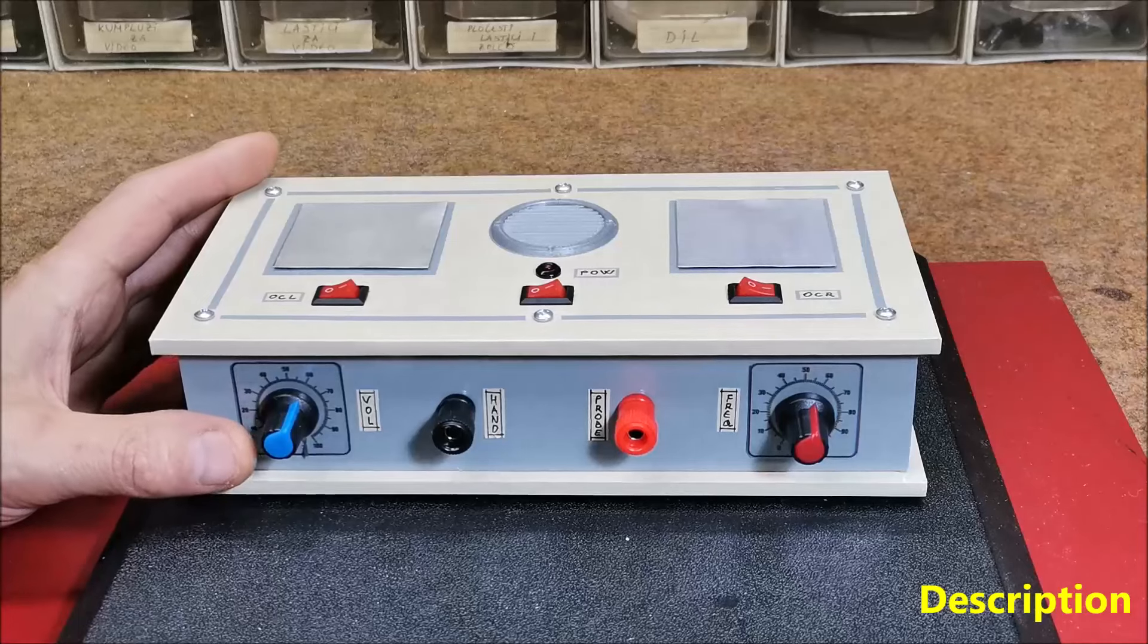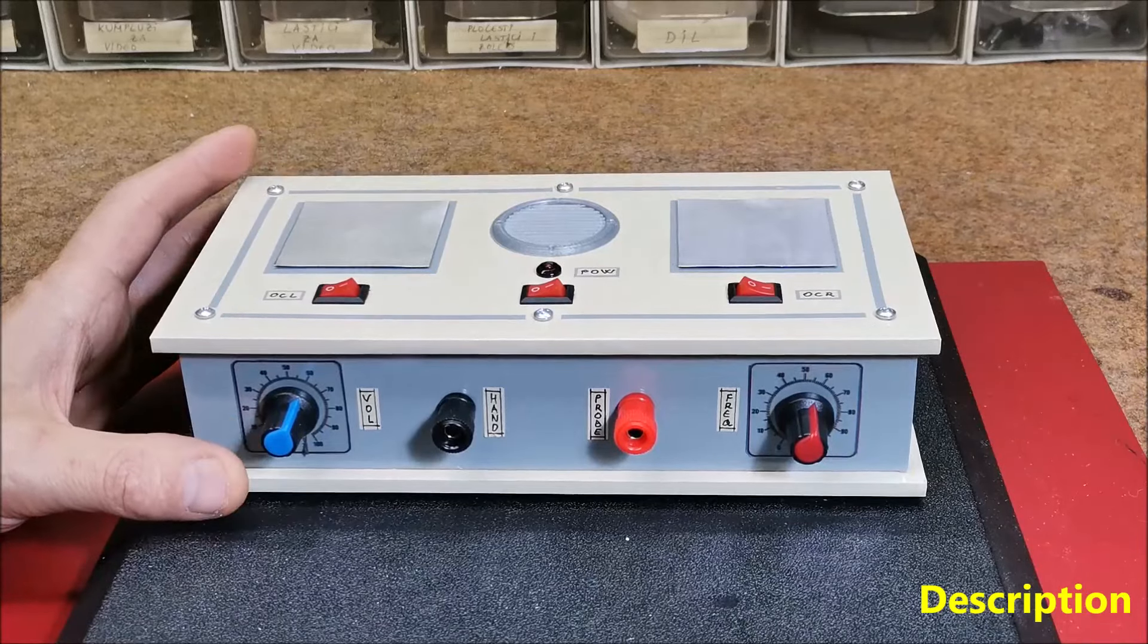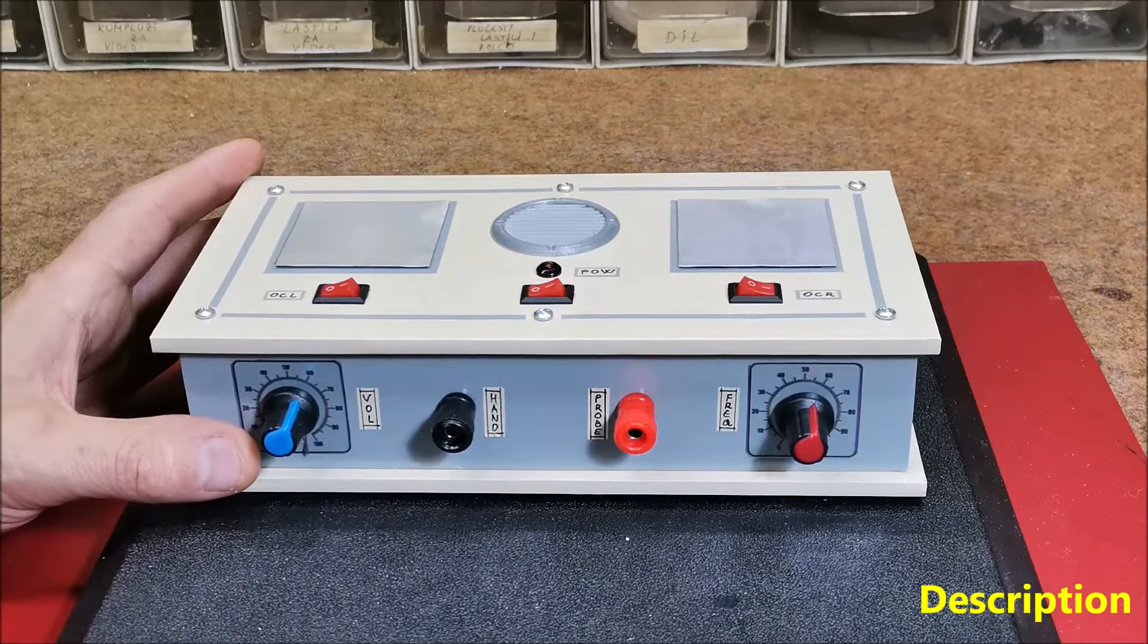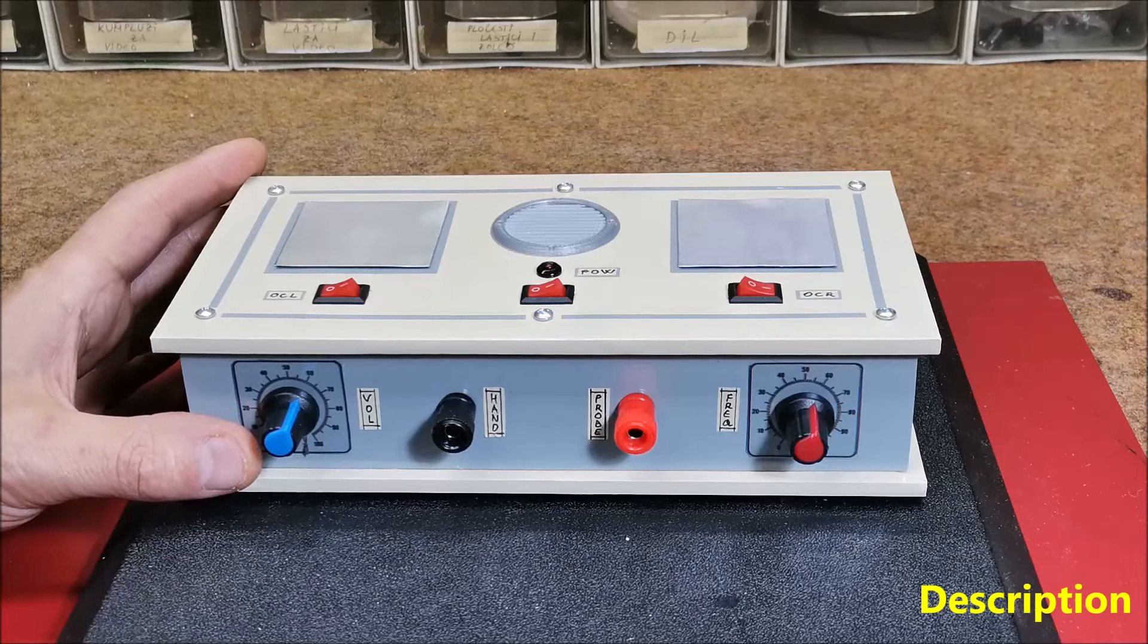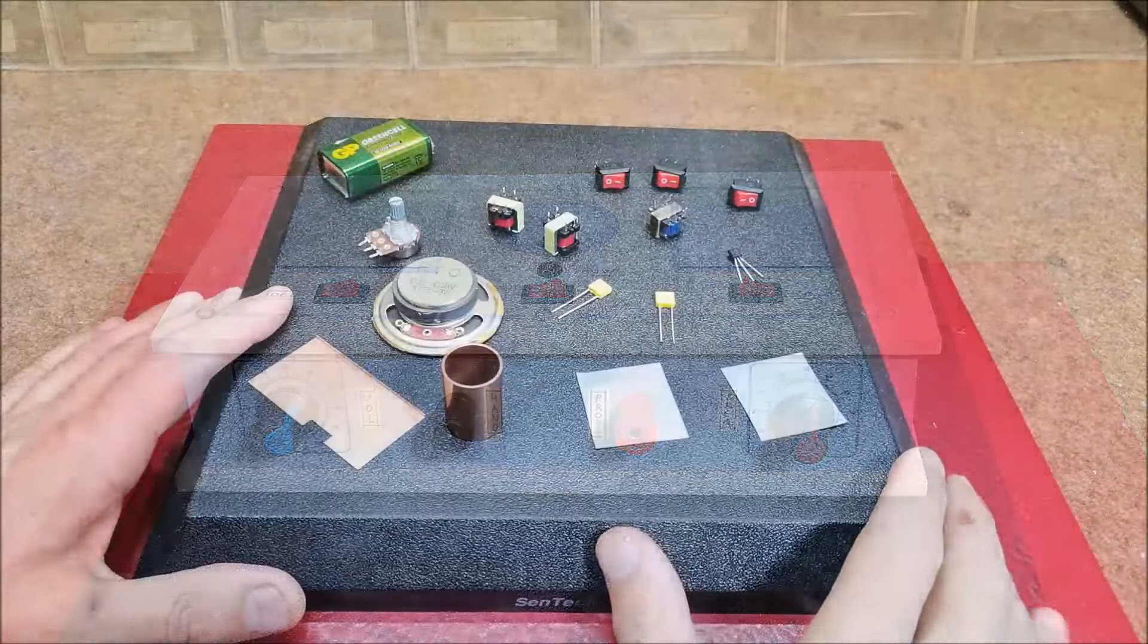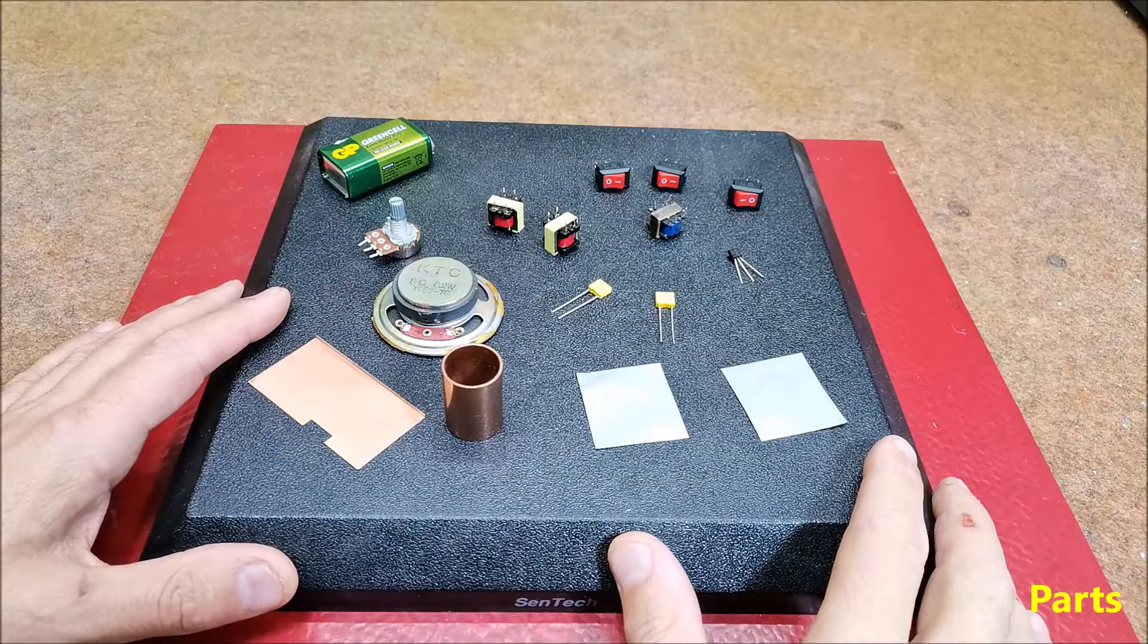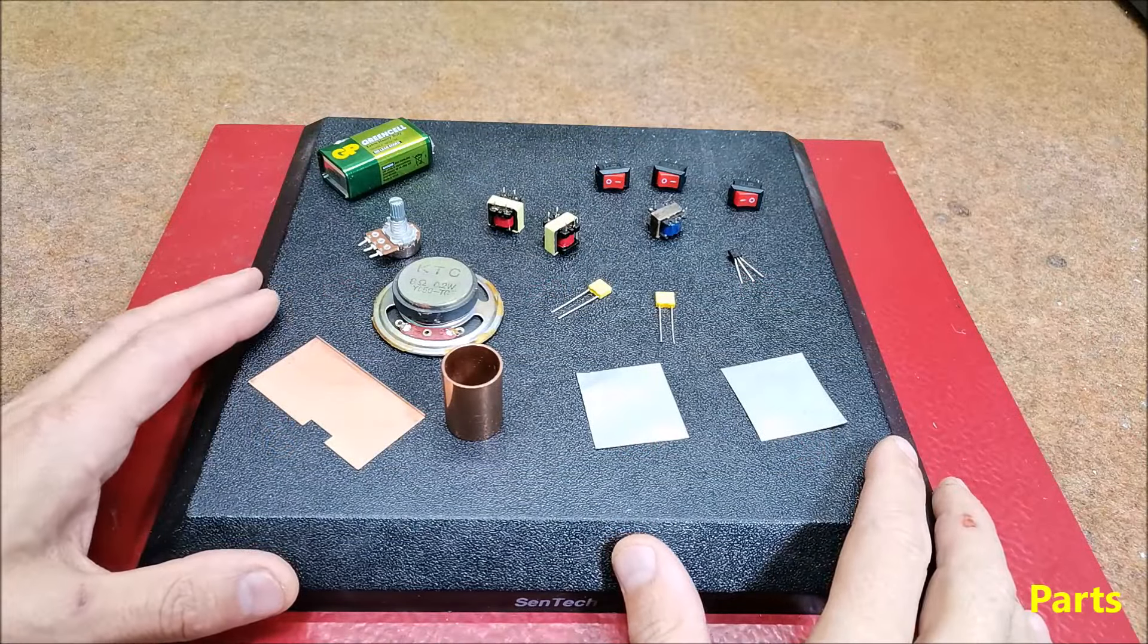I want to remind you that I will not at all explain the way of diagnosis using this method, but only the technical part, that is the way of its production. The basic version of this device was made at the end of the last century.